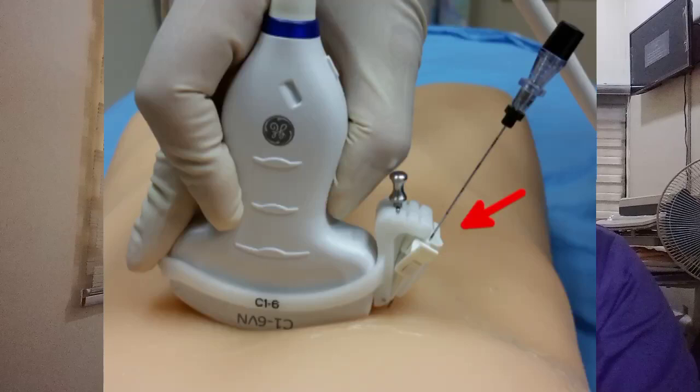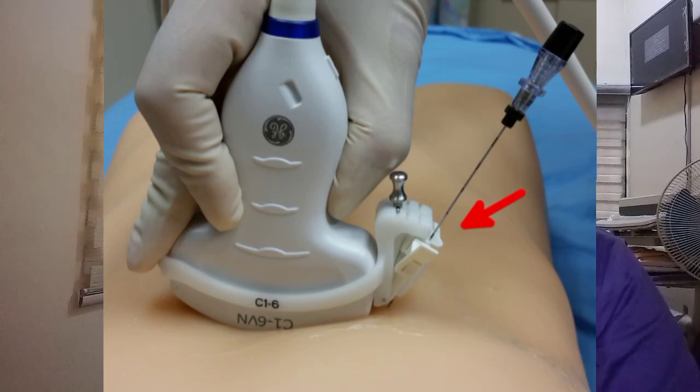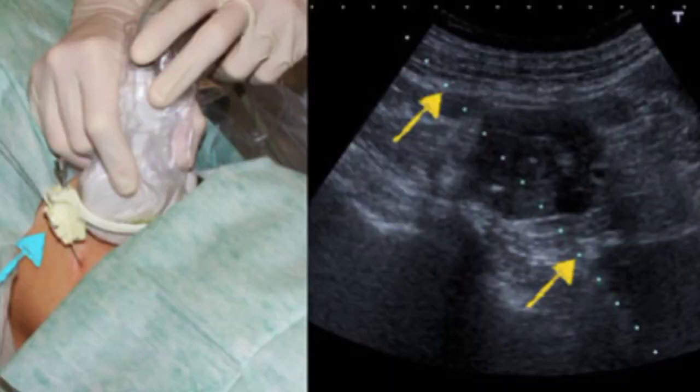And now this is a needle guide which is fitted on the transducer. This is how it's done with ultrasound guide. Now, when you use the needle guide, there is a predetermined track.